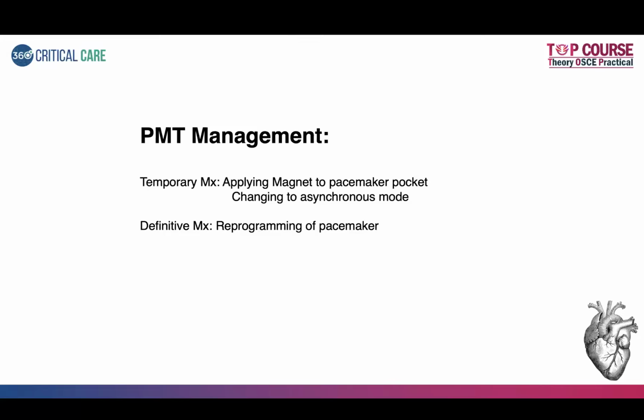So if there is a pacemaker mediated tachycardia, the temporary management is to apply a magnet to make it into an asynchronous mode. Whereas the definitive management will be reprogramming of the pacemaker, where, like I said, the representative has to come, there is a specialized computer or laptop for that, and to that the settings are adjusted.